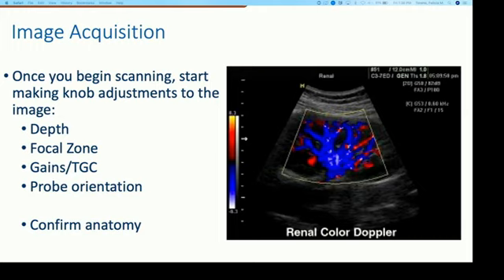And you're going to make sure that you pay attention to your notch so that your transducer has proper orientation. And then lastly, you're going to pay attention to your anatomy. Now this is big, and when you're on one side of the body or the other, it'll be easier, but always remember to pay attention.